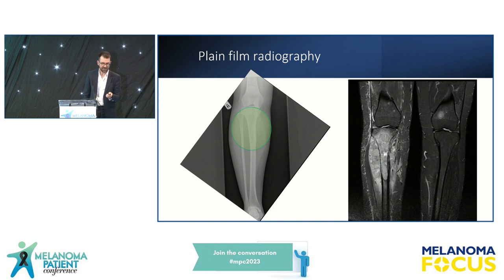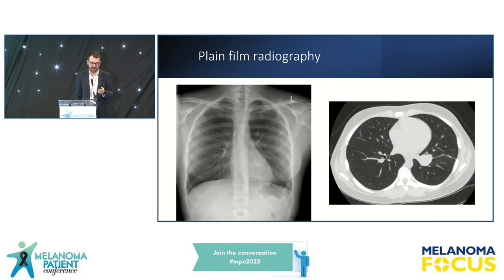Okay. So this is a 25-year-old female, actually, and she didn't have a diagnosis of melanoma. She was a very keen netball player, and she was complaining of pain in her lower leg, just below her knee, when she was playing netball. Perhaps some of the eagle-eyed amongst you will notice that the texture of the bone on the x-ray beneath the knee is just a little bit patchy, but there's not an awful lot to see. But she had an MRI scan just a week later, and that demonstrated a large tumour in her knee.